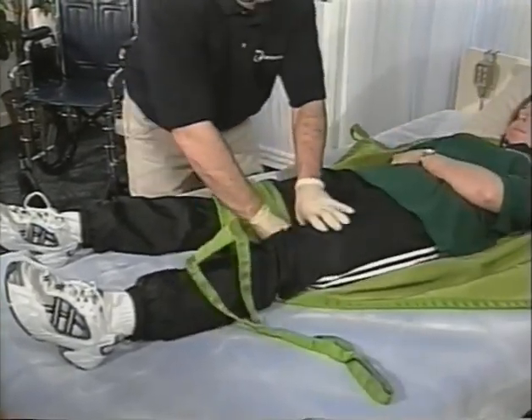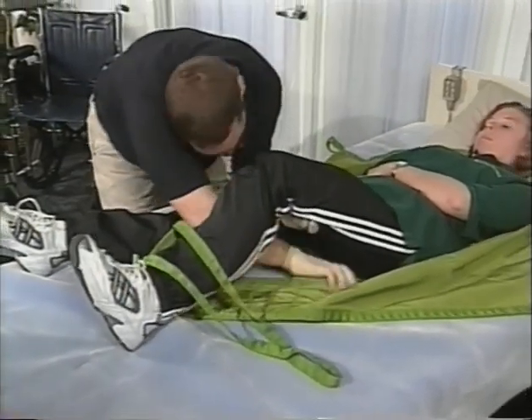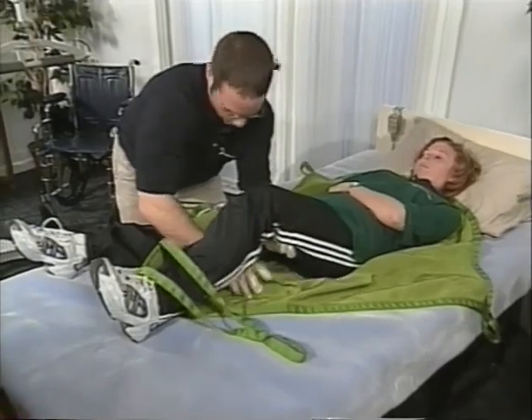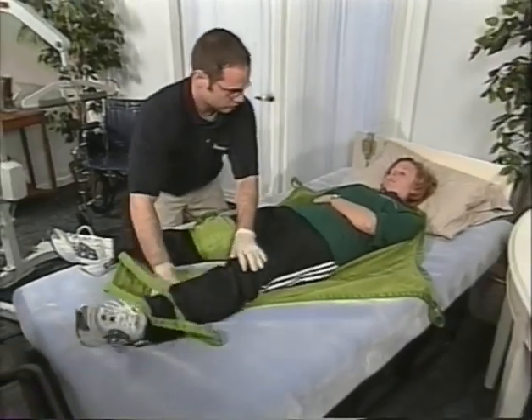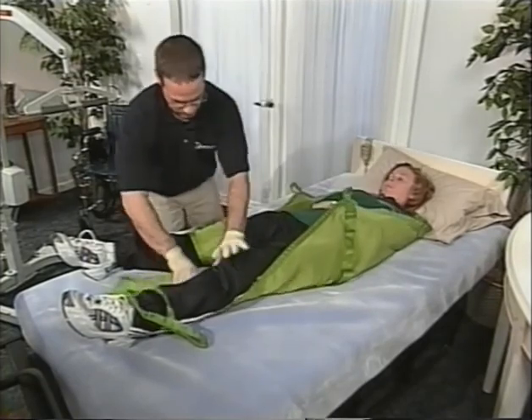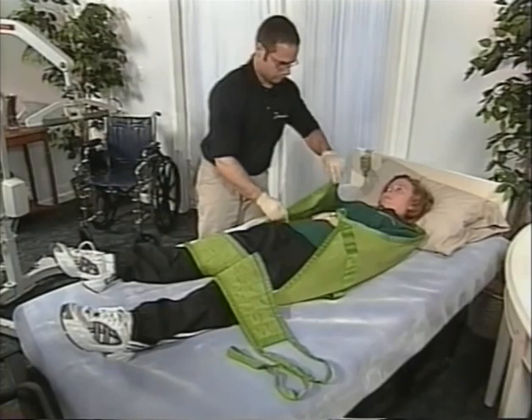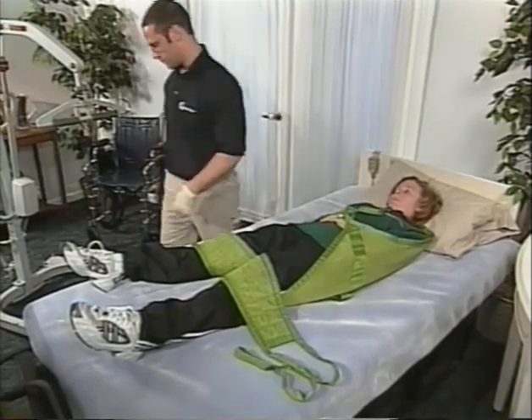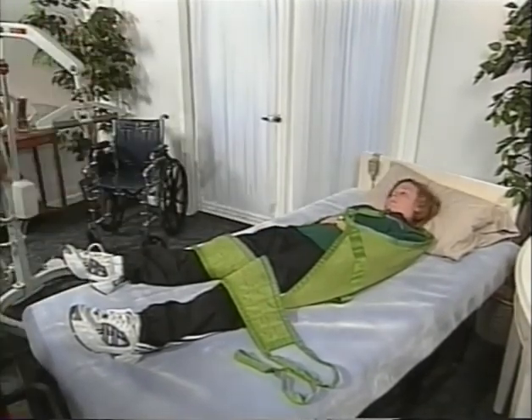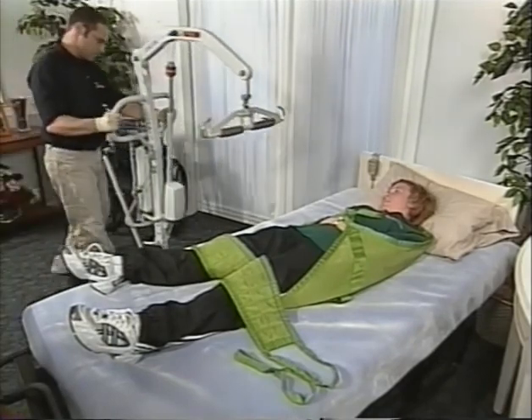Be sure to eliminate all slack and all wrinkles to avoid pressure areas. Maneuver the lift so it is over the client's chest, approximately 6 to 8 inches away from the body.